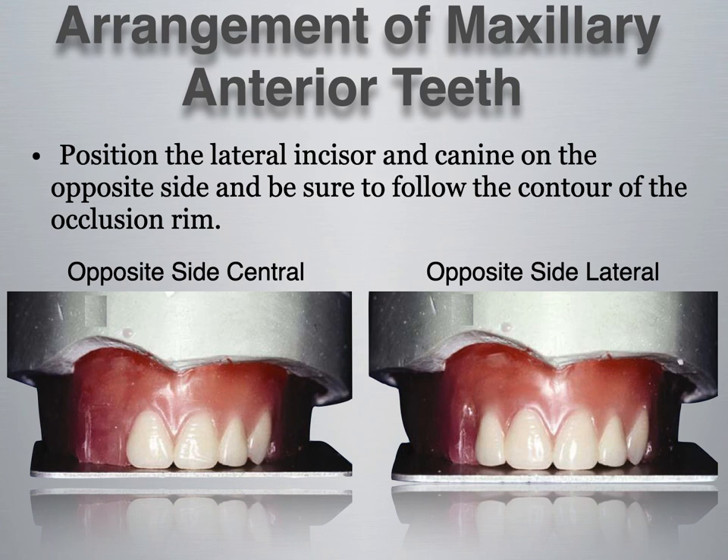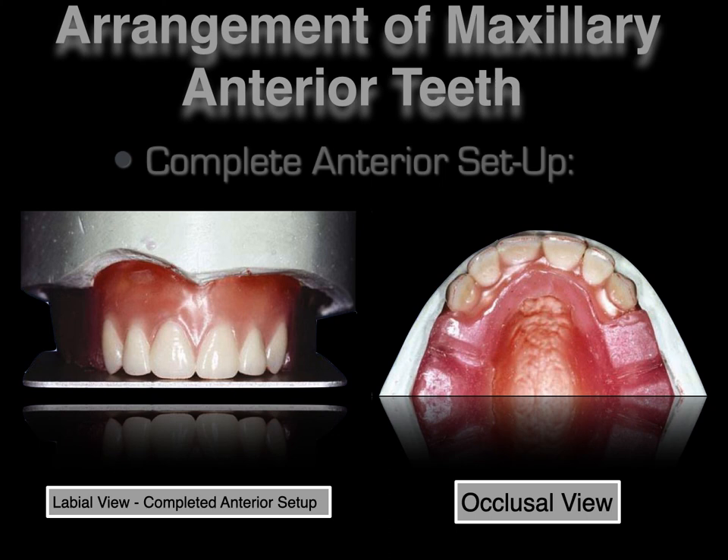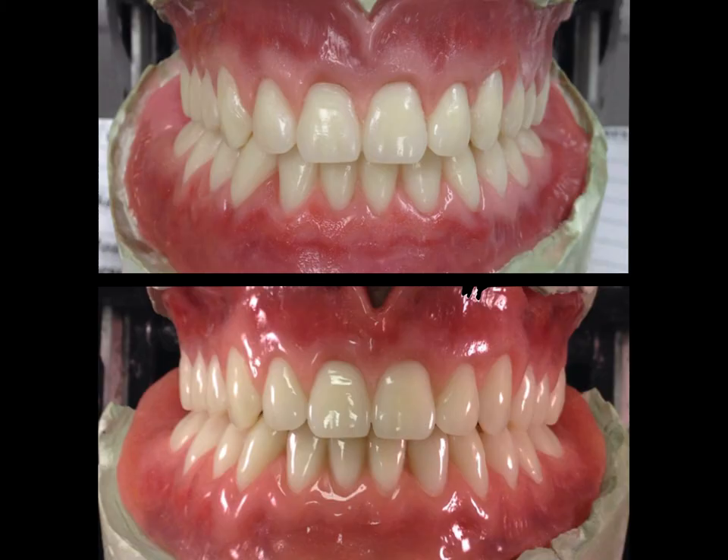Position the lateral incisor and canine on the opposite side, following the contour of the occlusal rim and all the same parameters, so the case comes out as a mirror image on the right and left. As we complete our six anterior maxillary setup, the central incisors and canines touch the plane, while the laterals are about a millimeter off the occlusal plane. The tooth with the most distal inclination among the six anteriors is the lateral incisor.